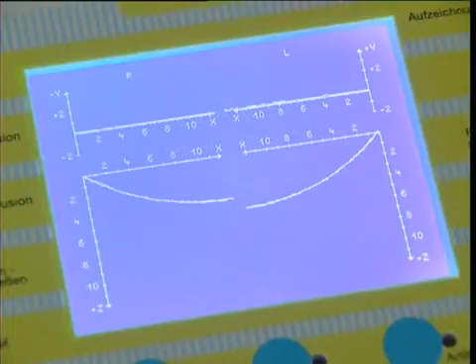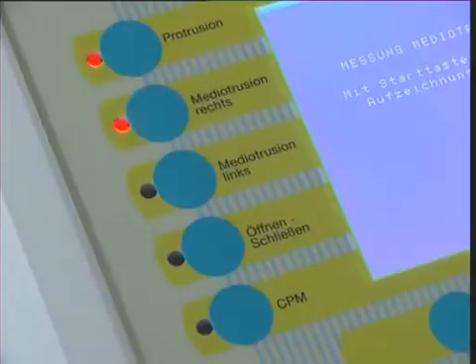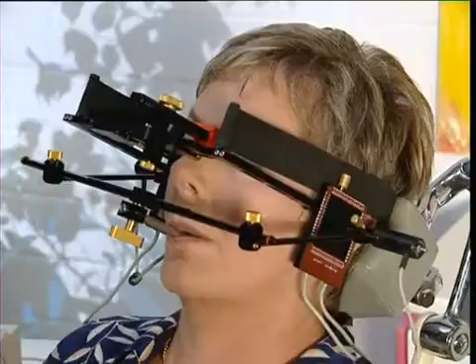Once the tracing has been calculated, it is displayed on the screen. If the tracing is to be discarded and repeated, press the protrusion key with your finger. Otherwise, the program simply continues and saves the last recording automatically. The remaining measurements are recorded as follows.